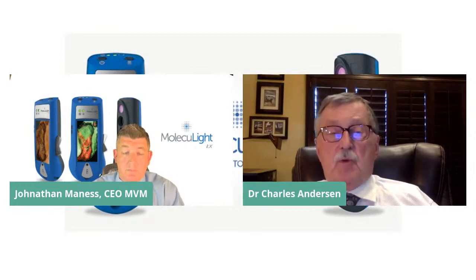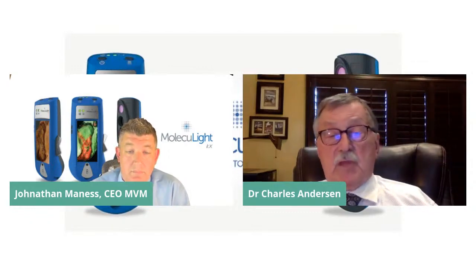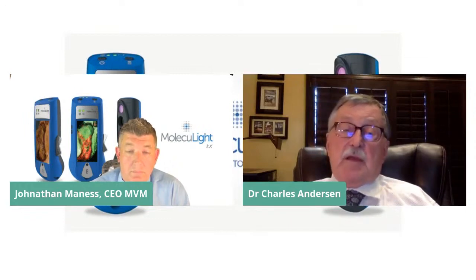Yeah, I think that when you get the information so that you can come up with a care plan, and you can be very selective based on that care plan and the information that you get both from the good history and physical and the additional information from the MolecuLight, then you're less likely to be kind of shotgunning the wound. Many times we see patients that have received recurrent treatments with antibiotics, and what they have is stasis dermatitis, for example. If you elevate that leg, all the erythema goes away. It's not cellulitis, but many of these patients have received many, many courses of antibiotics.